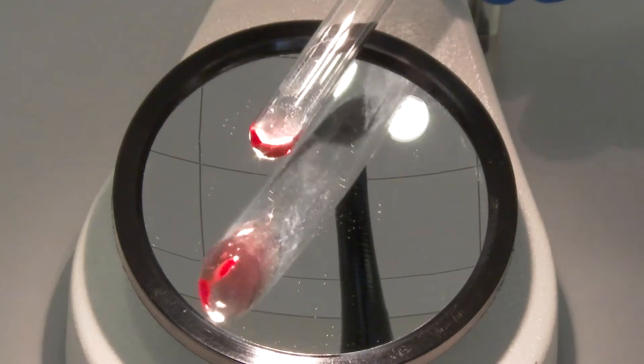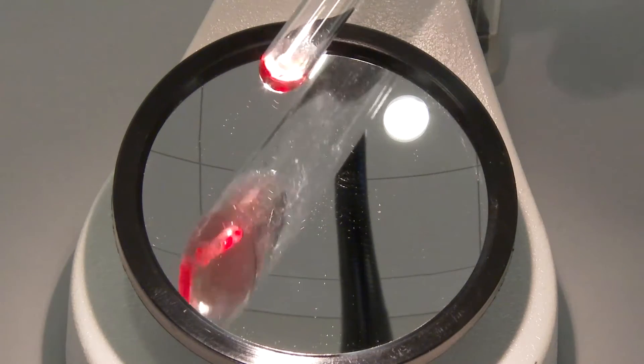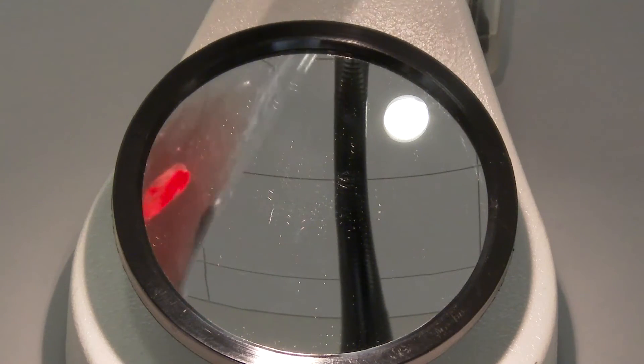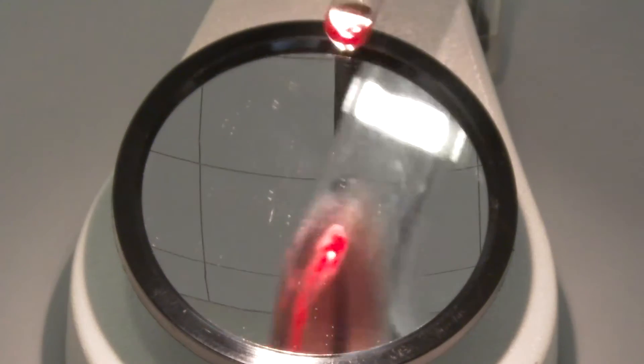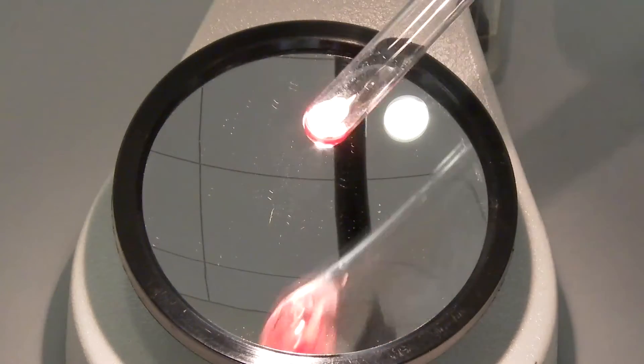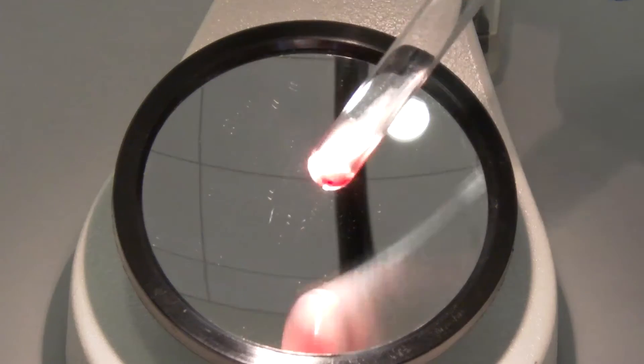The supernatant should always be checked for the presence of a pink or red color, which indicates hemolysis, before shaking the test tube. Once cells have dispersed into the solution, hemolysis may be difficult to detect.